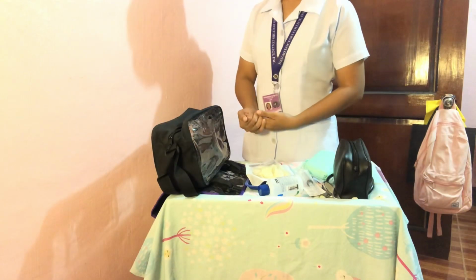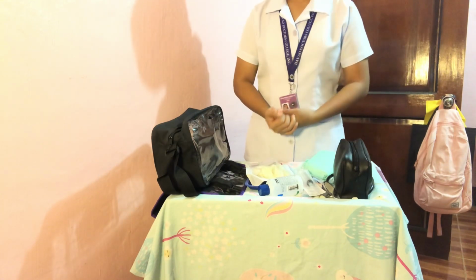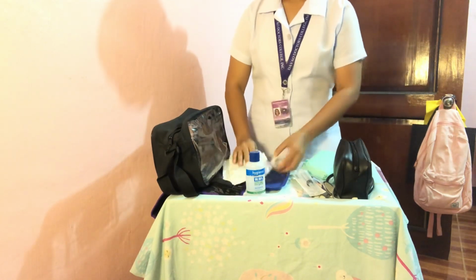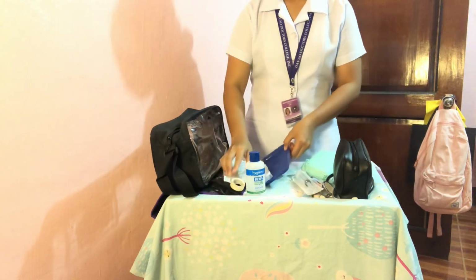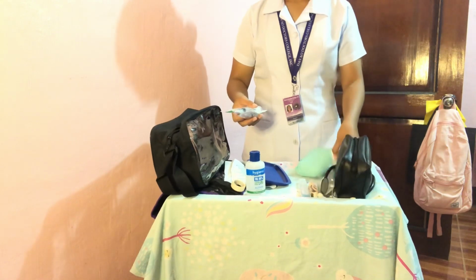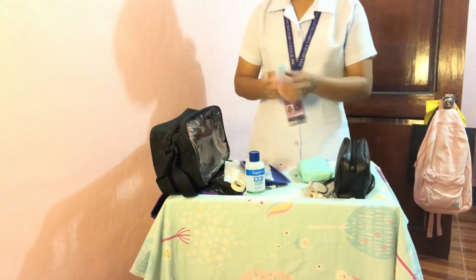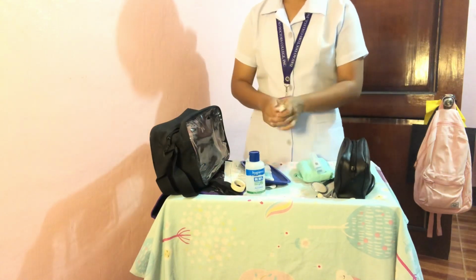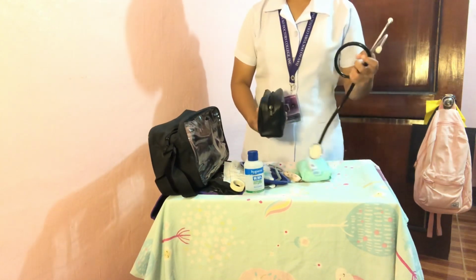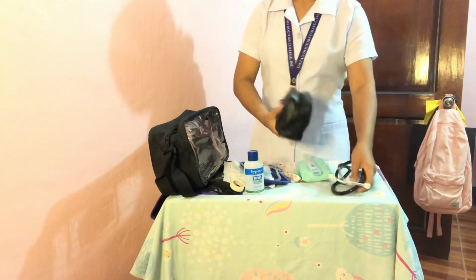I'm going to show you some of the materials that I have now, each one by one. First is the 70% alcohol, the surgical gloves, the adhesive tape, the kidney basin, the syringe, the bandage, the thermometer, the measuring tape, and the forceps. Also, I have the stethoscope and the BP apparatus. Let's proceed to the next procedure.